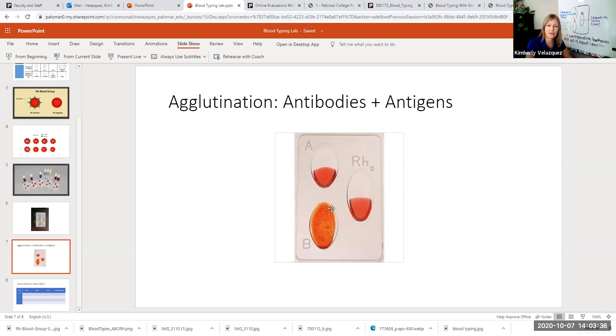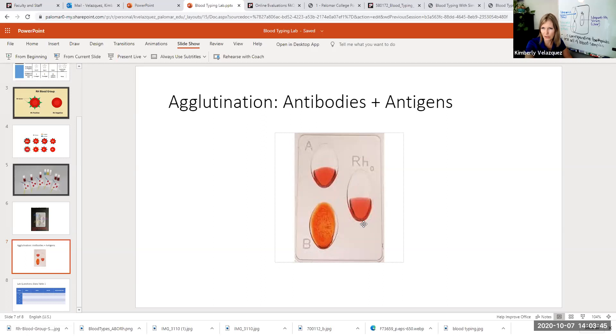So that means type B antigen was present on this blood sample, on the cells in this blood sample, and therefore agglutination occurred. There wasn't a type A antigen present and there wasn't an RH antigen present. So no agglutination occurred here. That means this person's blood would be B negative.